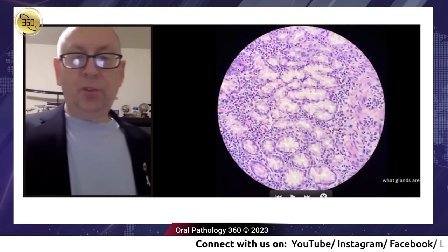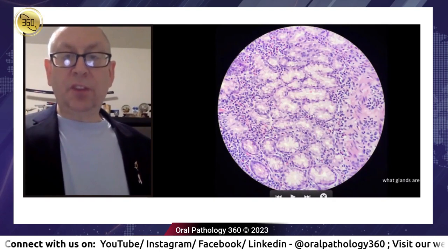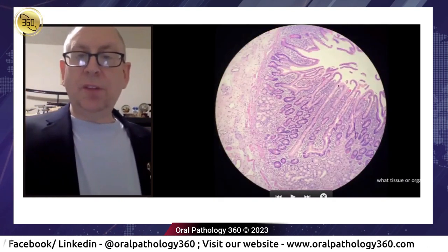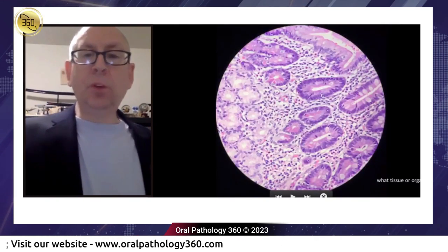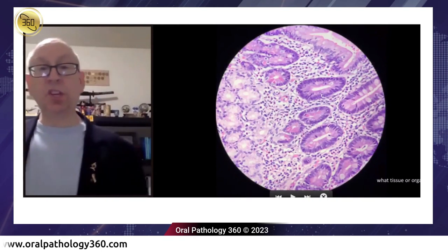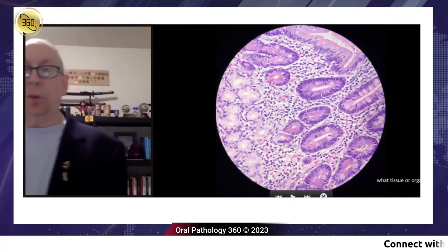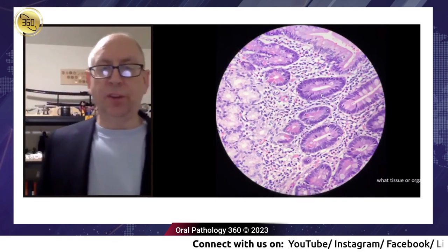So you have mucus glands in the areas. There are some eosinophils here because there's always some inflammatory component to this. You do have these long crypts. Their job is to absorb. When you look at the gland sideways, this is what the GI pathologist is looking for. When it looks a little blue like this, they have to ask, am I looking at atypia? Am I looking at a colon cancer? In this case, it wasn't.